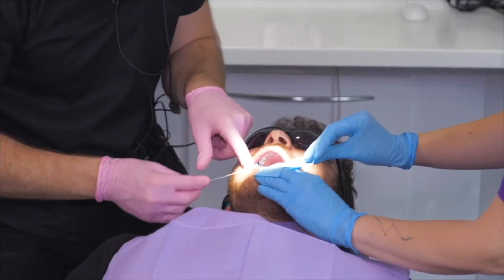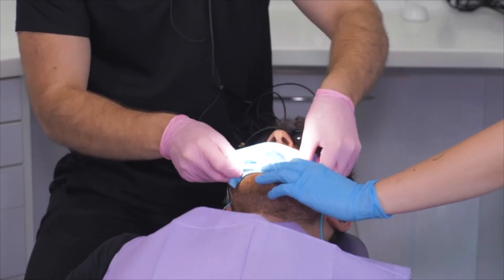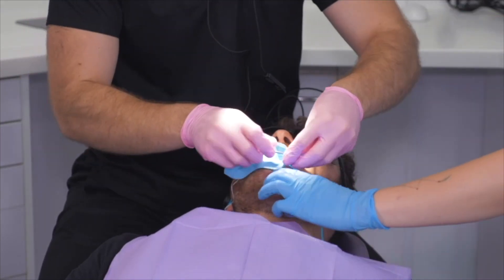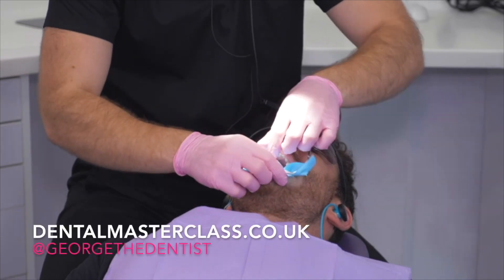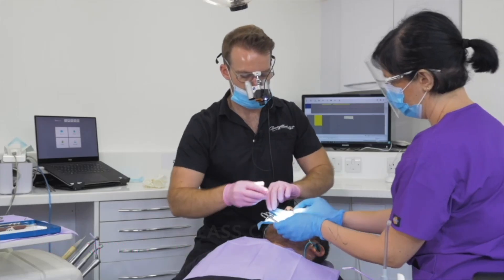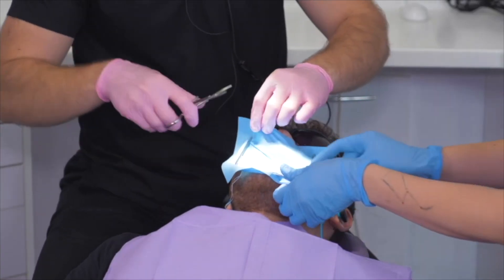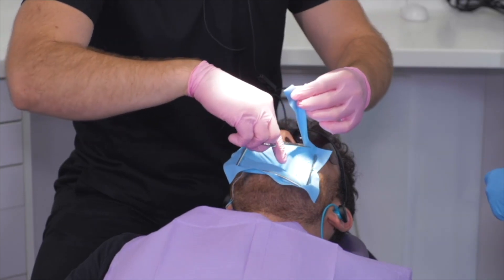Just relax your jaw. I find the mouth prop helps a lot during these long appointments. So clamp's on, mouth prop's in. Get the frame on like this. And I will trim this rubber dam down a little bit here so it's not over his nose — try not to give him a shave at the same time.